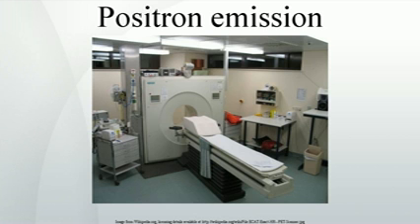For comparison, radiation dosage for other medical procedures ranges from 0.02 mSv for a chest X-ray to 6.5 to 8 mSv for a CT scan of the chest. Average civil aircrews are exposed to 3 mSv per year, and the whole-body occupational dose limit for nuclear energy workers in the USA is 50 mSv per year. For scale, see orders of magnitude (radiation). For PET-CT scanning, the radiation exposure may be substantial, around 23 to 26 mSv for a 70 kg person. Dose is likely to be higher for higher body weights.